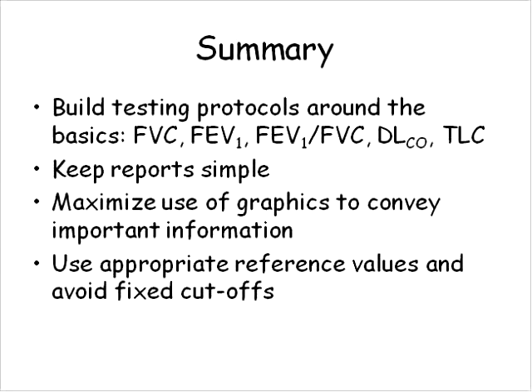And that can be done in our lab when we can remove the tube, or if the patient just has a stoma. We've found that pediatric resuscitation masks can many times be held over the patient's stoma to allow connection to the breathing valve or to the flow sensor to allow things like the slow vital capacity to be measured, even to do body plethysmography or diffusing capacity tests.